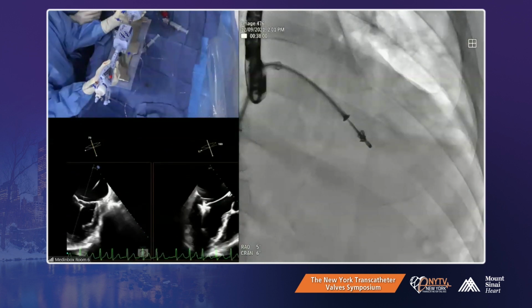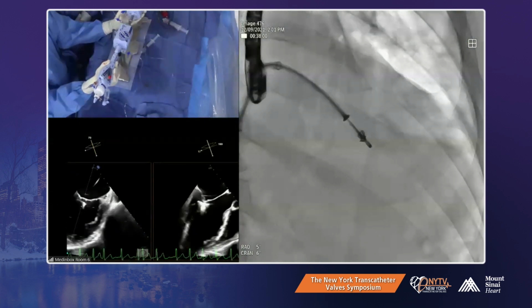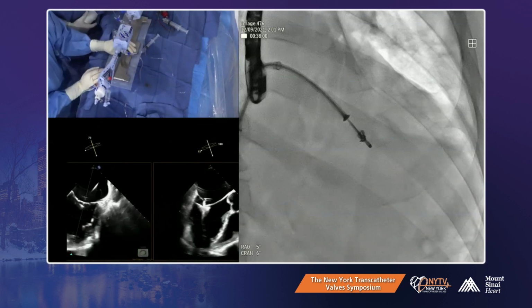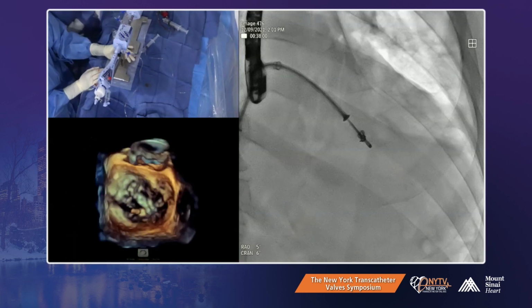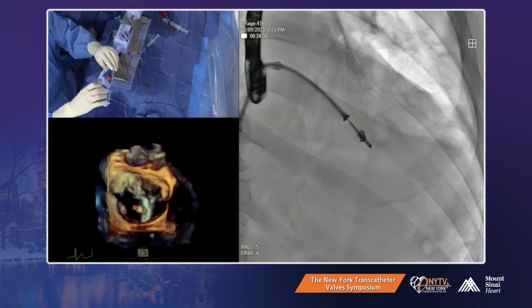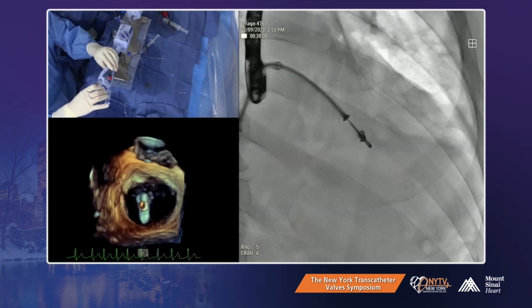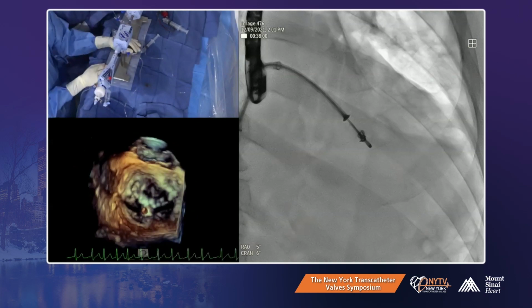Release the anterior leaflet. Don't give it. It's not helping. And your intercommissural trajectory looks off. Let's do 3D. We can do 3D one more time. Yeah, let's see the 3D one more time. Orientation always has been right. Yeah, 3D looks perfect. Every time 3D has been good.